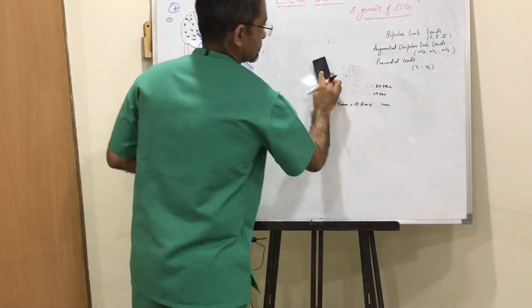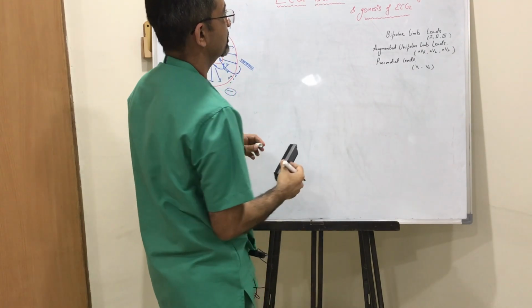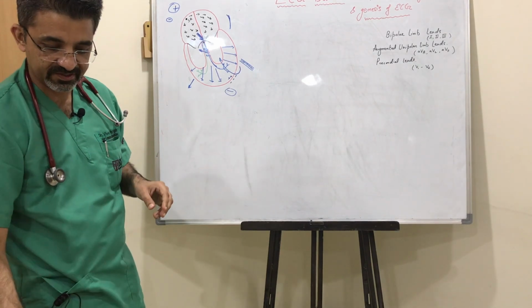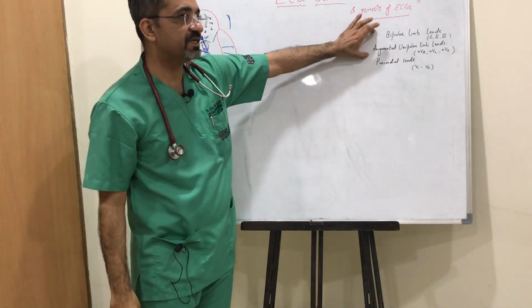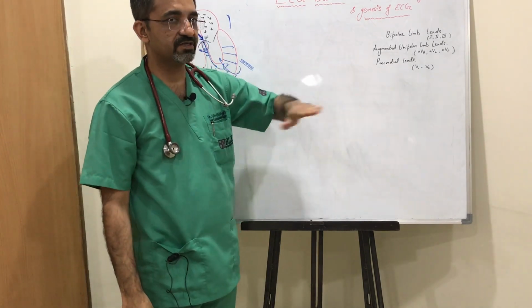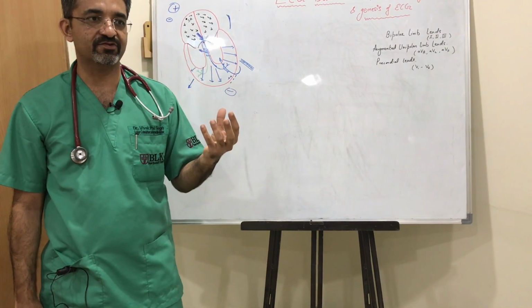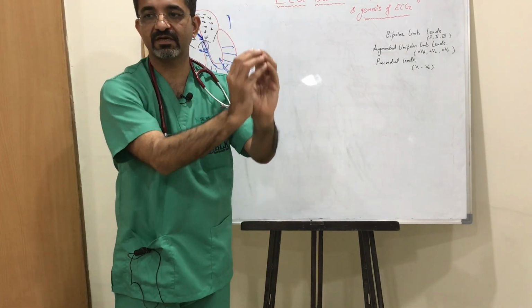So okay, friends, we have probably finished our vectorial analysis. In just 2 minutes we'll briefly summarize what we have learned. We understood that there are 6 leads in the frontal plane, right? We have 6 leads in the transverse plane. Each lead has a positive electrode. That positive electrode is the eye of that lead, that means that's the camera from which you are looking towards the heart.